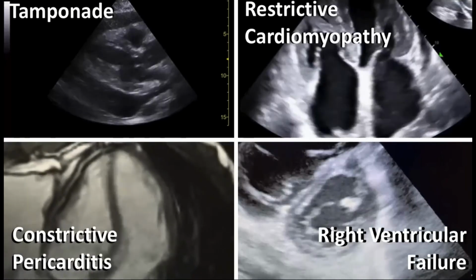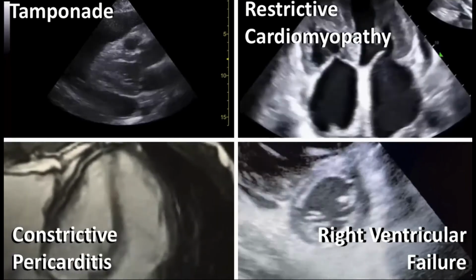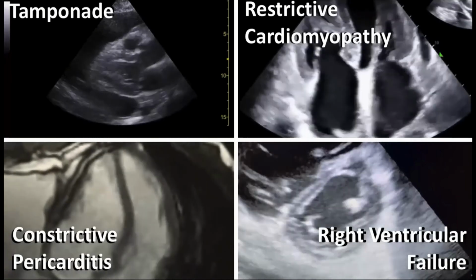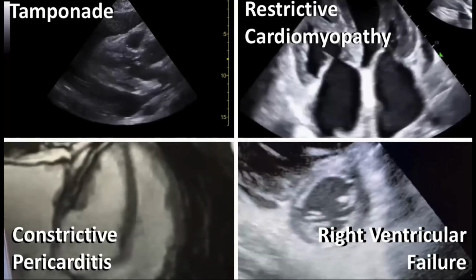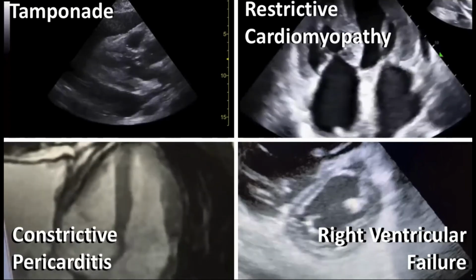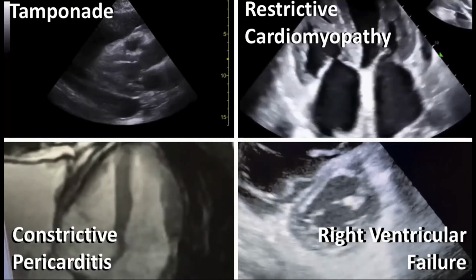However, this means the IVC is not as useful to evaluate congestive organ injury. If one of these patients develops, for example, acute kidney injury, one of the best ways to know whether this worsening in renal function is due to congestion or not is to go ahead and perform the VExUS score to precisely grade the severity of congestion, going from VExUS 0 to VExUS 3. The worse the venous congestion, the more likely that organ dysfunction can be attributed to venous congestion itself.